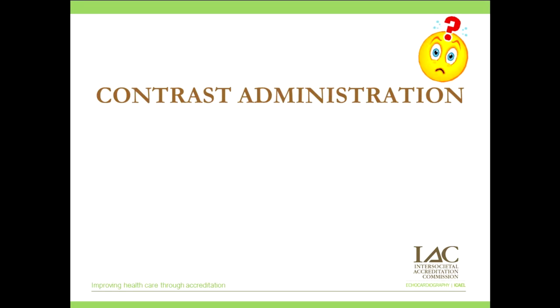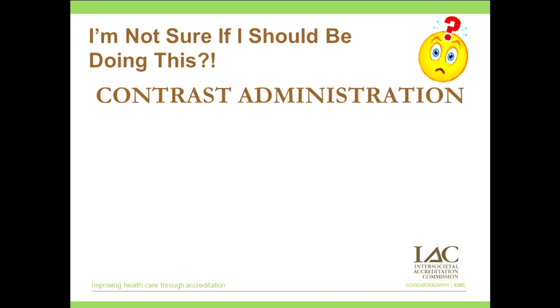Contrast administration. We ask ourselves this all the time. I'm not sure if I should be doing this. In an ideal situation, a physician or a nurse can administer contrast. However, when they're not available and a written policy is in place, a sonographer might perform this function.